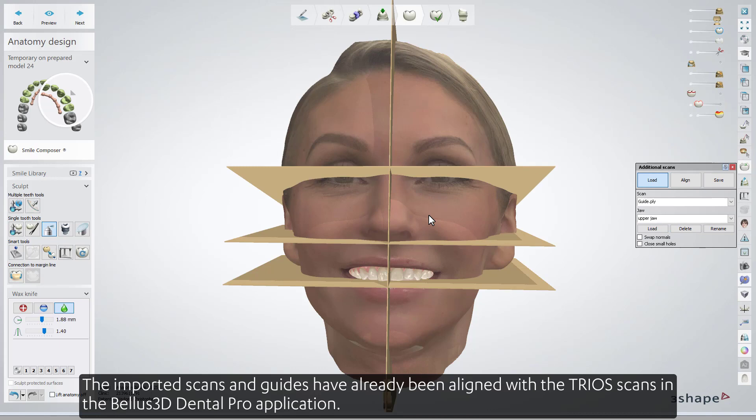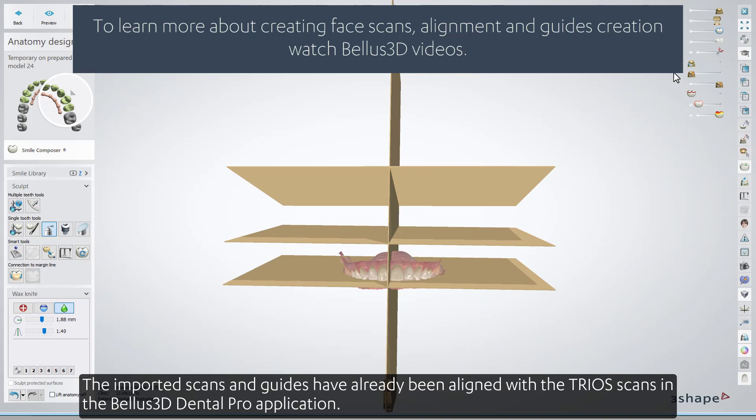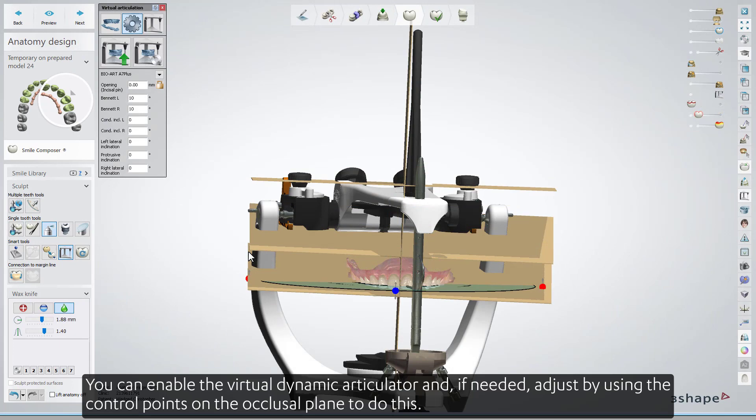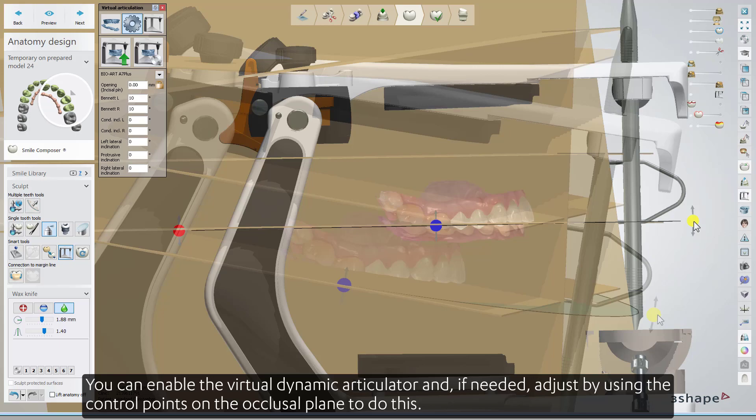The imported scans and guides have already been aligned with the TRIOS scans in the Bellis 3D Dental Pro application. You can enable the Virtual Dynamic Articulator and, if needed, adjust by using the control points on the occlusal plane.